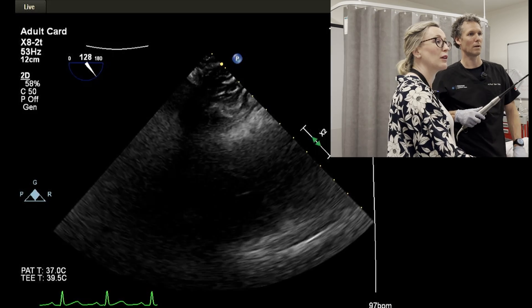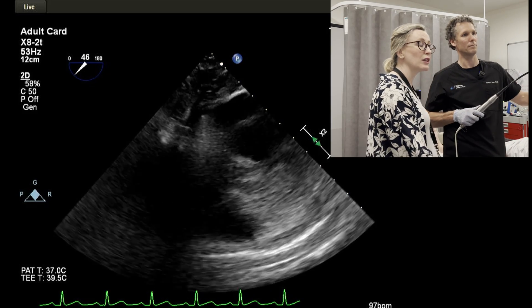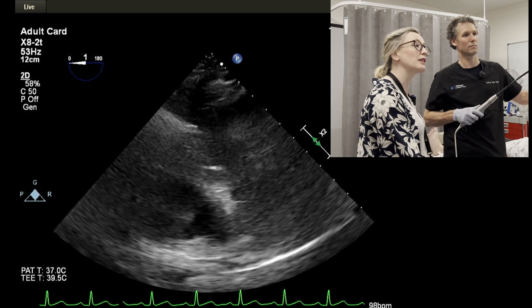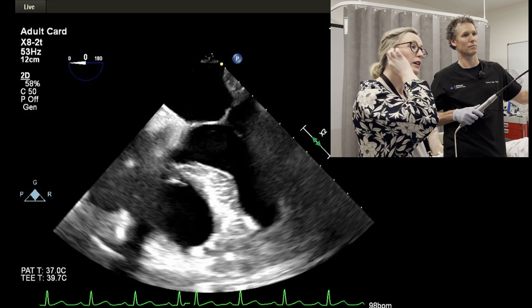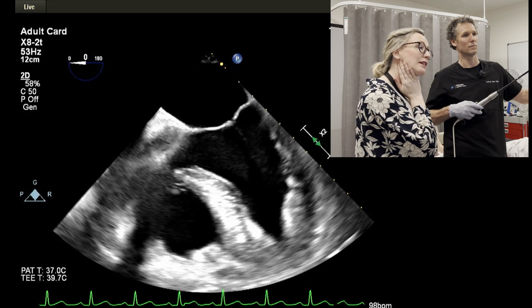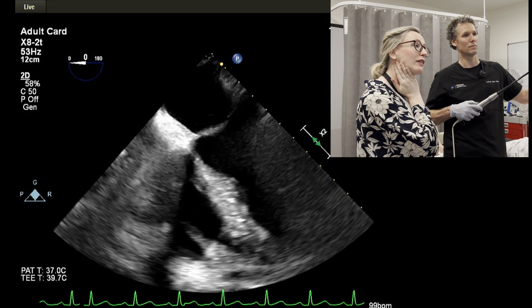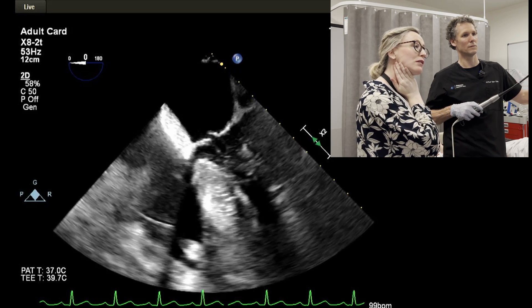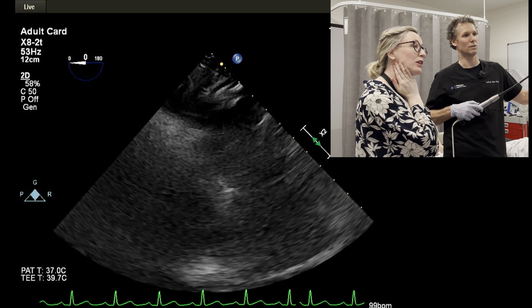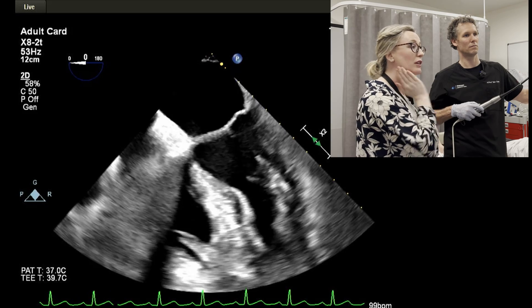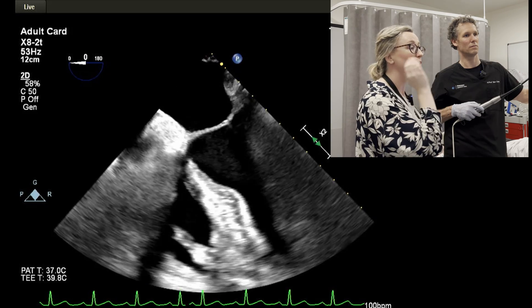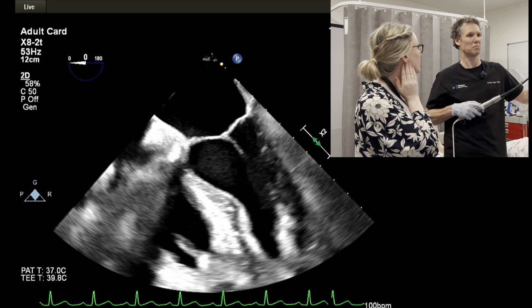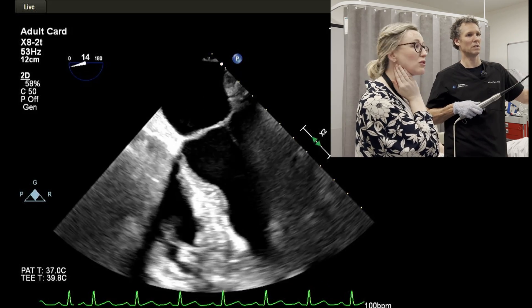So now we're going to go to our money views — the mid-esophageal views — where you often get more of your 2D assessment of the aortic valve. We can do the long axis of the aortic valve first and then move to short axis.